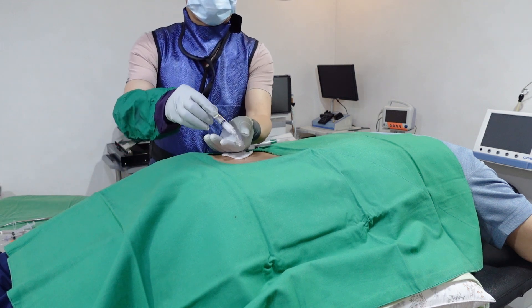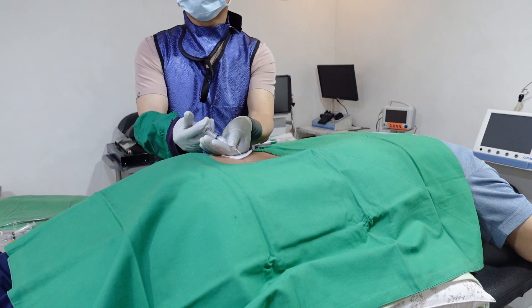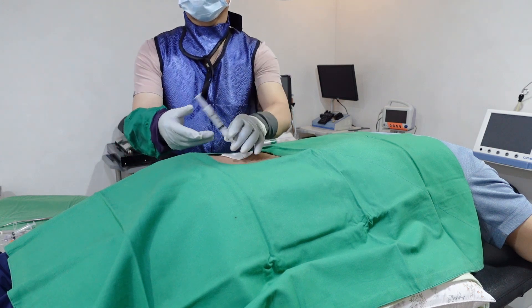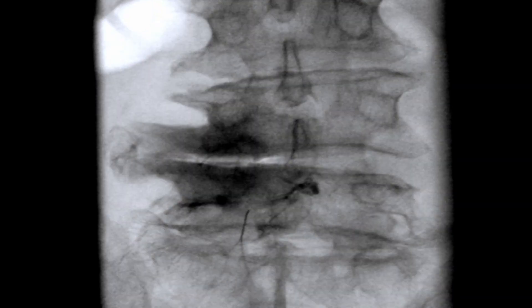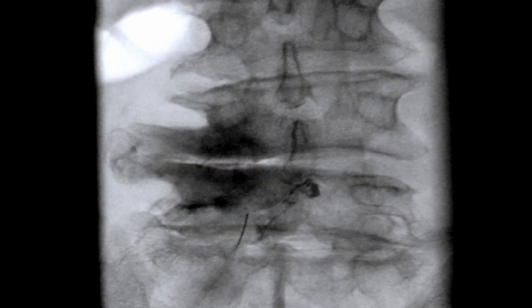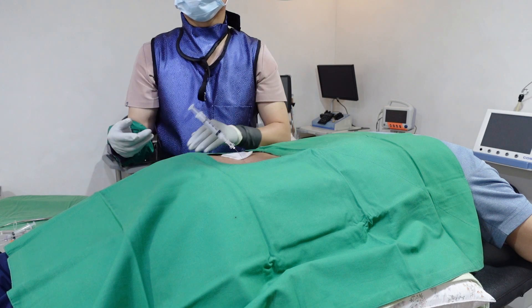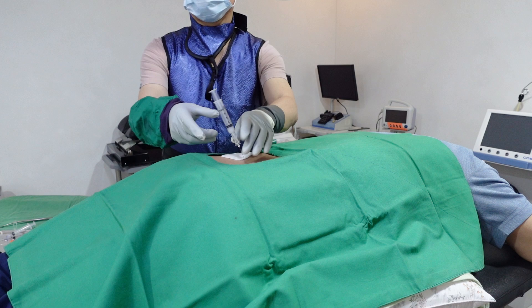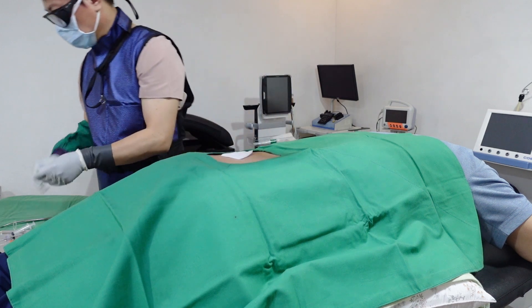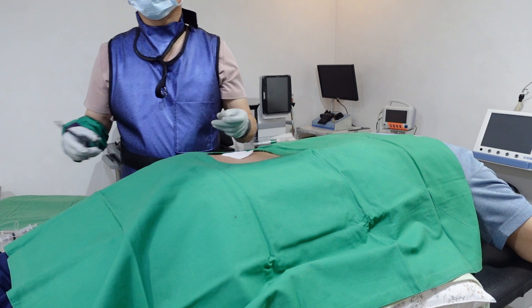Allow me to proceed with injecting one milliliter of the steroid cocktail. Here's a valuable tip: injecting a volume that is too excessive can exacerbate compressive symptoms. While this is not a concern in cases of mild central stenosis, it can induce unbearable pain in severe stenosis. Therefore, limiting the total volume to one milliliter is advisable to avoid this complication.